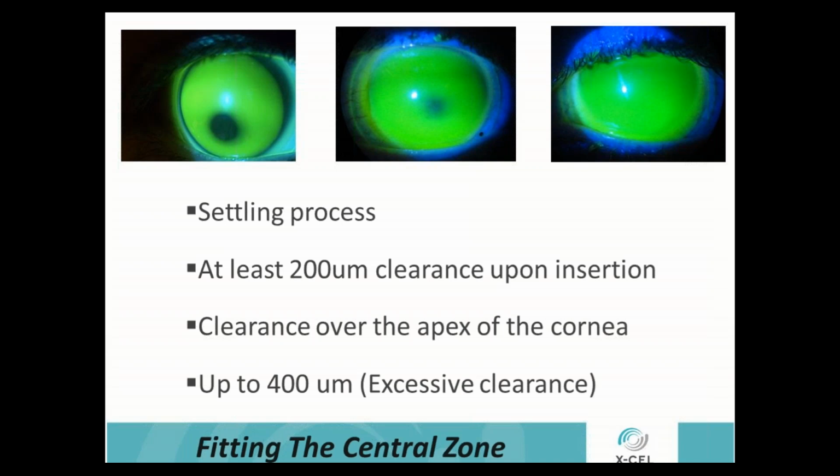So you get buildup behind the lens because we have so much room and so much fluid and tear behind there that buildup stays there. With sclerals, it's almost stagnant and we don't get much exchange of fluid. So any buildup that gets behind that lens tends to stay there. So if you can reduce your clearance, it can help with that fogging or haziness behind the lens.